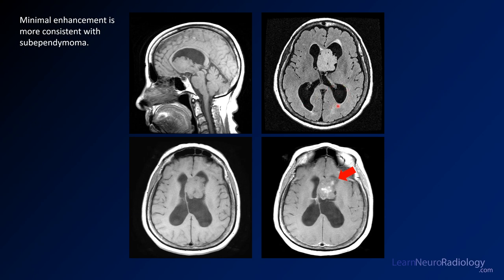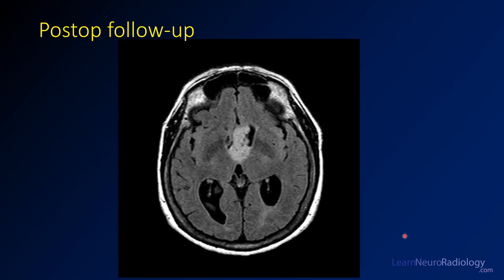You can see the ventricles are far too big even for someone in their 60s, so this person has hydrocephalus, which is probably causing the symptoms. This is a post-op follow-up — they went in through a ventriculostomy, took a small piece to make a diagnosis, and will probably just shunt the hydrocephalus for now. It's a relatively indolent lesion that doesn't have to be completely resected.